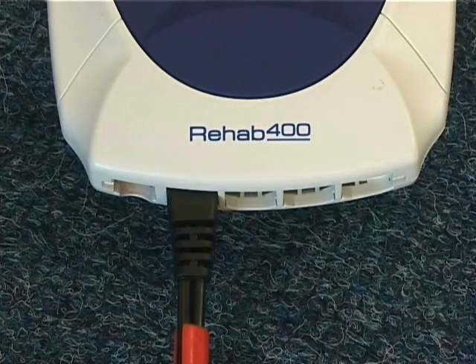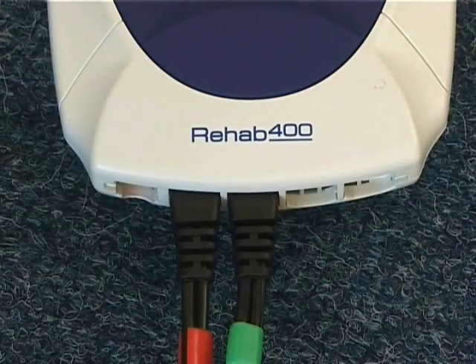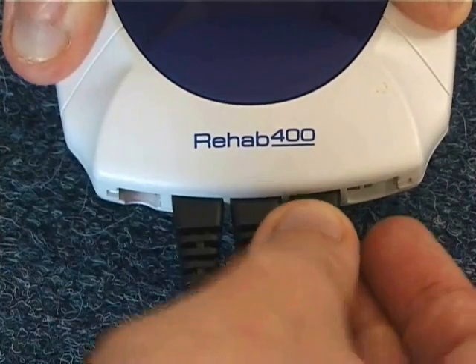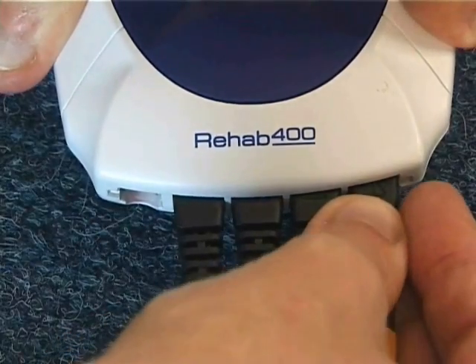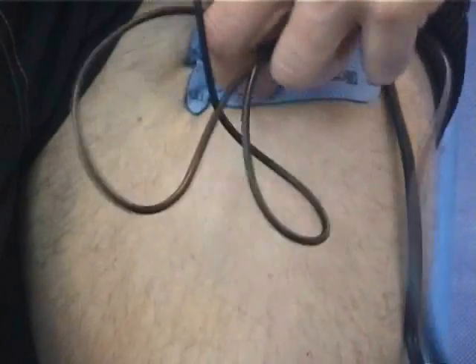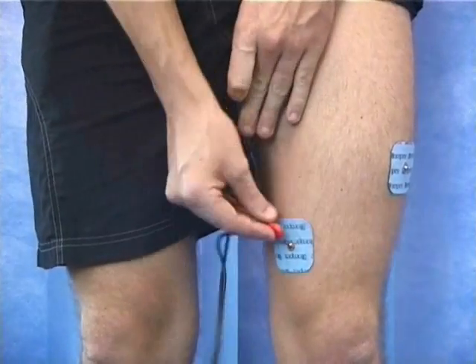Repeat the same placement on the other leg. Now connect the electrodes up. You need to make sure that you attach the red part to the square pads and the other to the top, making sure that the same lead is on the inside or outside respectively on both the upper and lower pad.